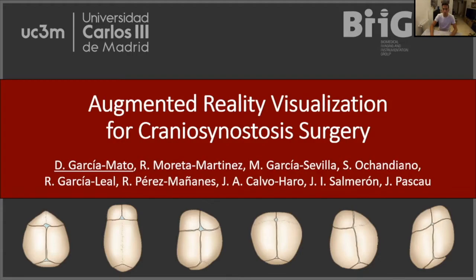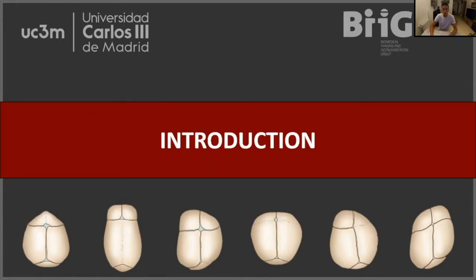Today I'm going to present my work called Augmented Reality Visualization for Craniosynostosis Surgery. I will start with a brief introduction to the topic.